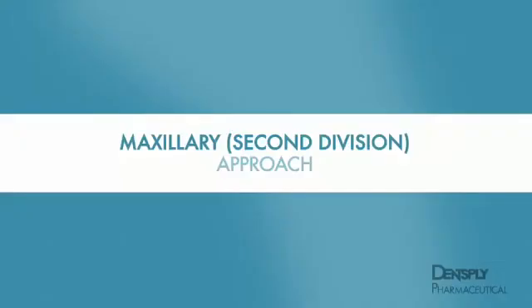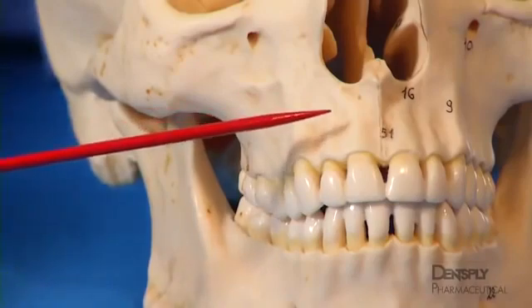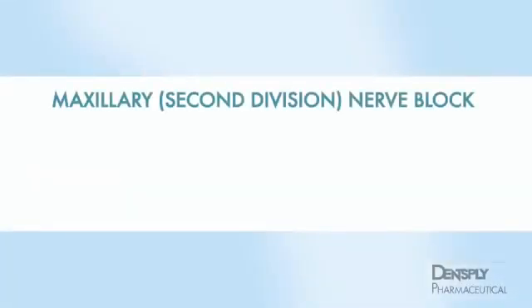Maxillary nerve block. The maxillary or second division nerve block will anesthetize the entire hemimaxilla with a single injection. The target of the injection is the maxillary nerve as it passes through the pterygopalatine fossa. 3 approaches to the maxillary nerve block are possible.